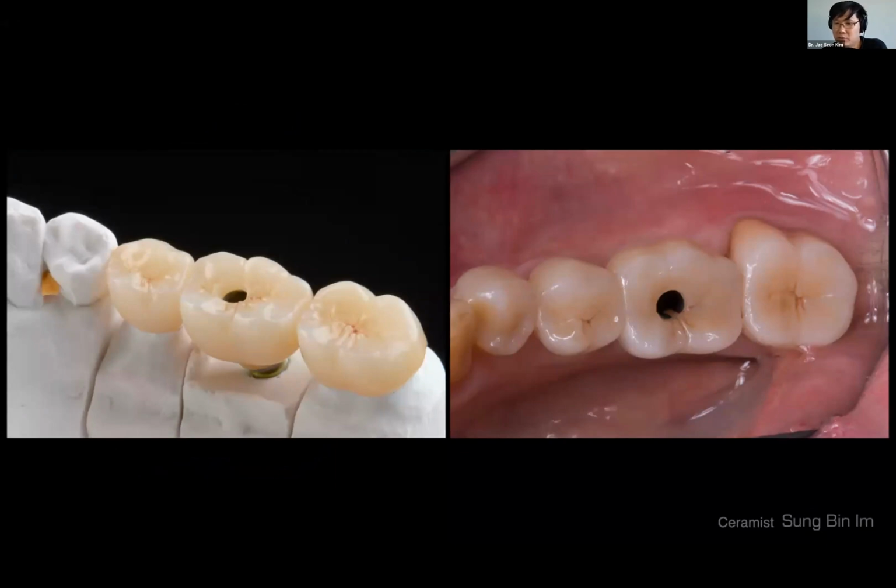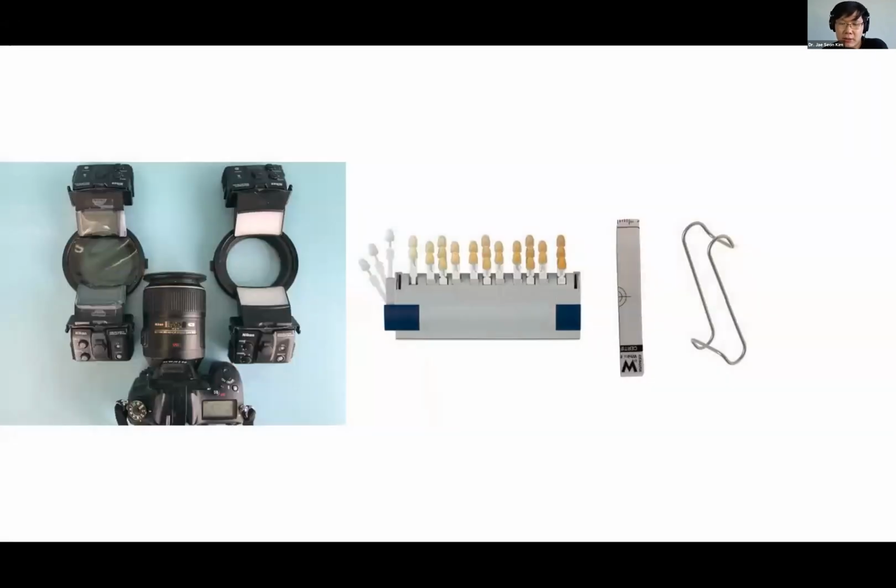And also the occlusal surface stain is very, very nice. And that is why I always have a mirror, an occlusal mirror. The reason why I start out with taking the polarizing pictures is I take the polarizing filter off, and I put on my regular flashes. And after I take it with the gray card, I actually put the occlusal mirror in and take occlusal shots and buccal shots of all the teeth that are natural.